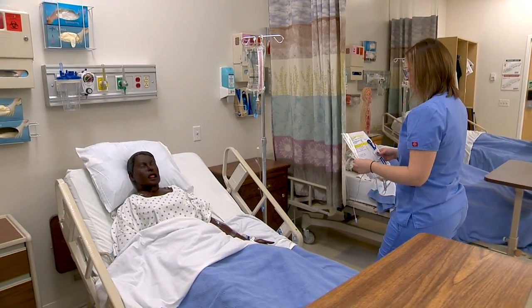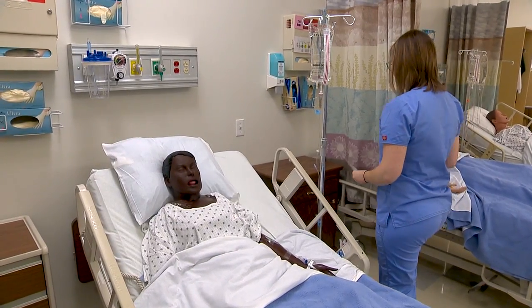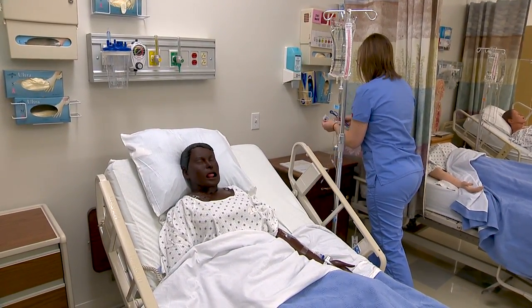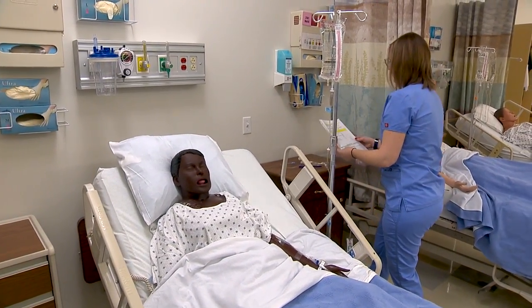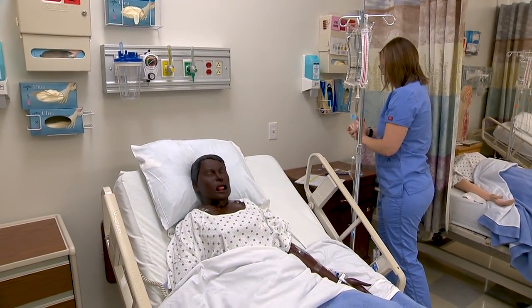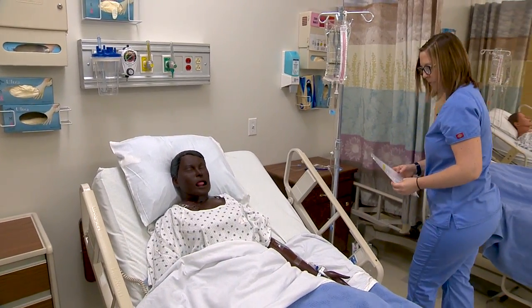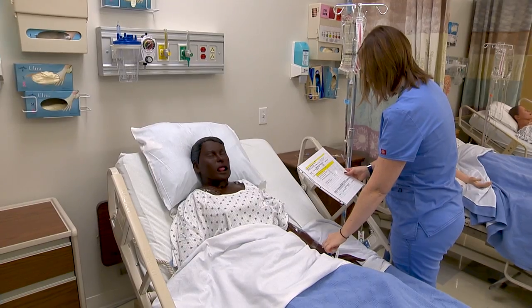Hey Morgan, it's Sara, your nurse. I'm here to give you your IV antibiotics. How you doing? Good. Any pain? None at all. Okay, I need you to go ahead and verify your name and date of birth for me. It's Morgan Brown, 8/4 of 70. Great, that's what I have here.